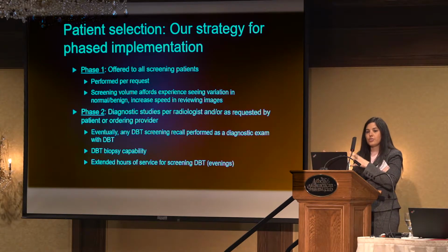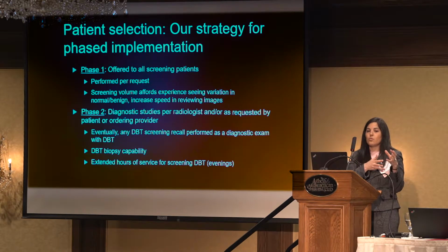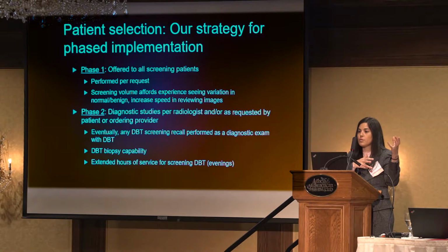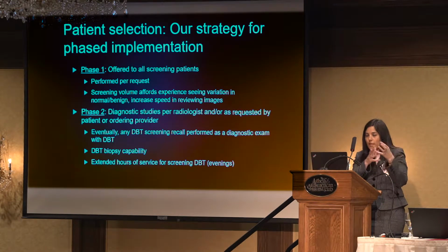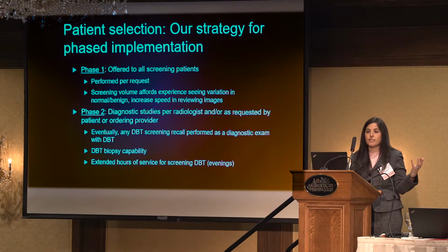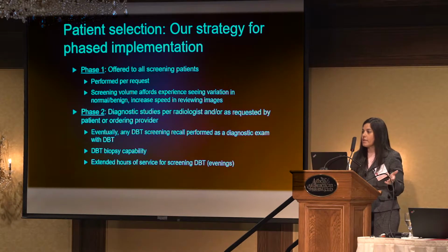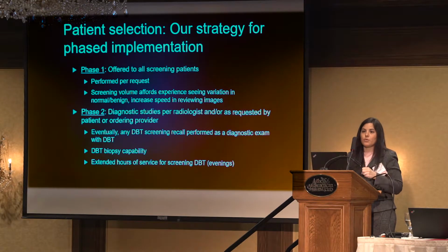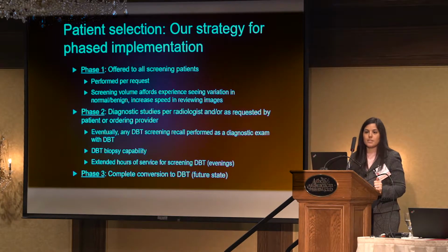And we did have to actually shift our patients' schedule, right? As we started adding these diagnostic slots, we had to take some of those screening tomo spots, right? Because we didn't have unlimited resources of rooms. And now we had this backlog of screening patients wanting tomosynthesis. We had to extend our hours of service into the evening. So we offer evening screening DBT appointments to accommodate the downtime when we're using the tomo room for biopsies or for diagnostic patient appointments. Phase 3, we're not there yet, but complete conversion to a complete tomosynthesis practice.